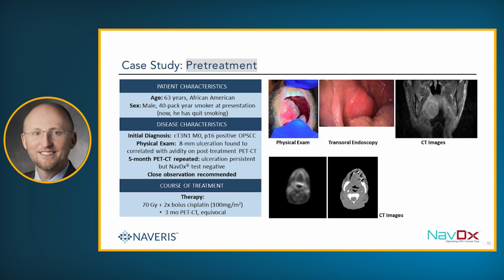in California presented with. So this is a gentleman who walks into my clinic, and he's 63. He is pretty much an active smoker. He quit yesterday. And it's one of those things where I was able to get him in, and of course the referring person was like, "Hey, seems really exophytic. Maybe you could do the robot on him."